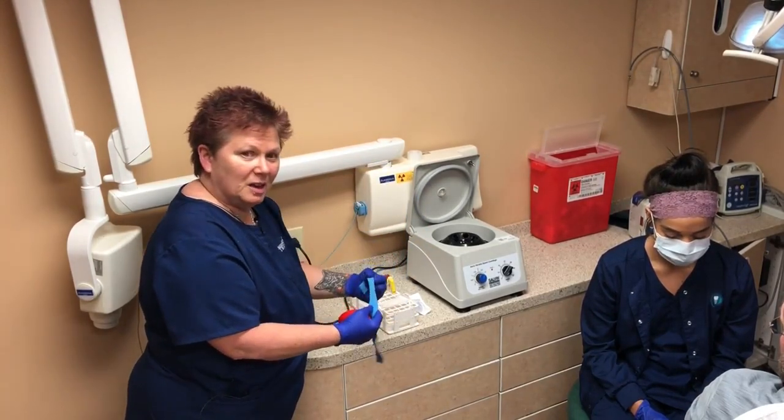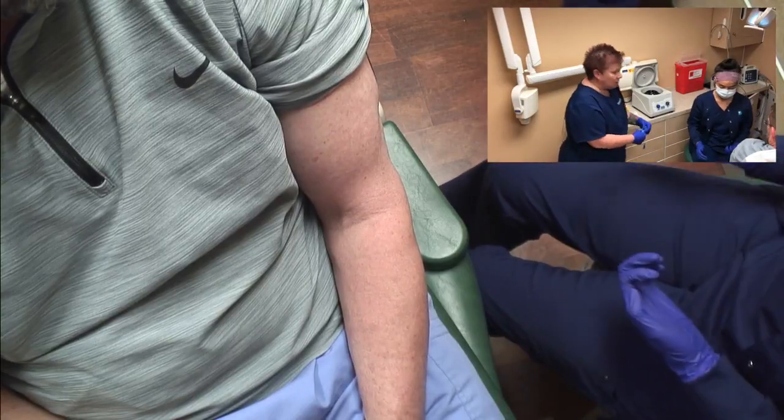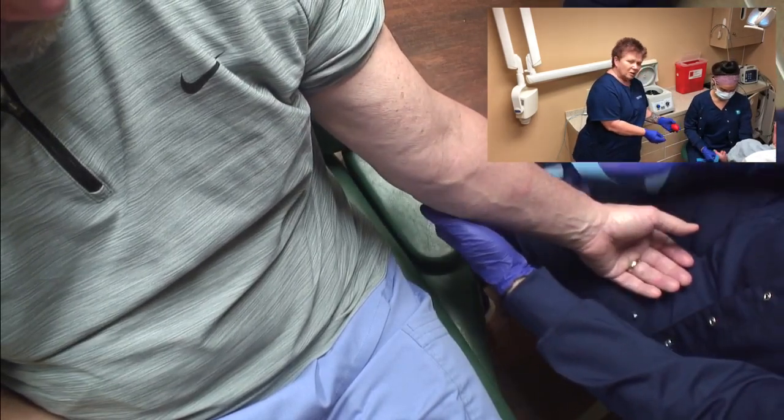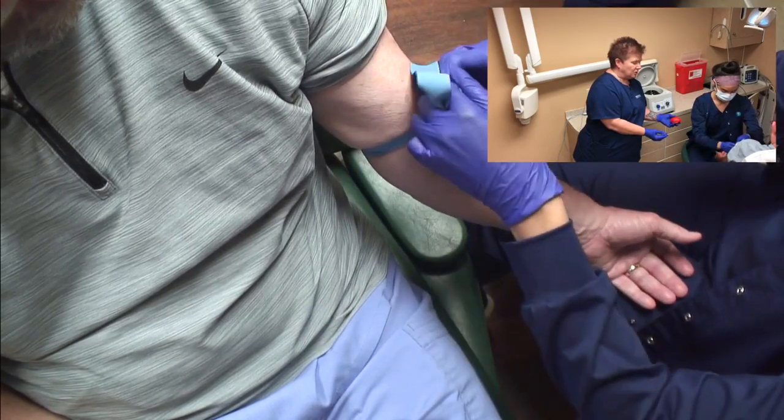I'm going to hand all these items to China to help her do the blood draw. China's going to take Dr. Heller's arm and she's going to make her best choice on a site to draw the blood.